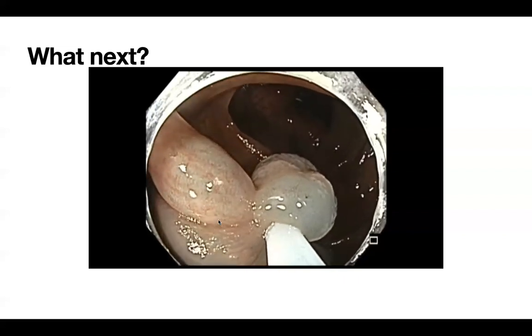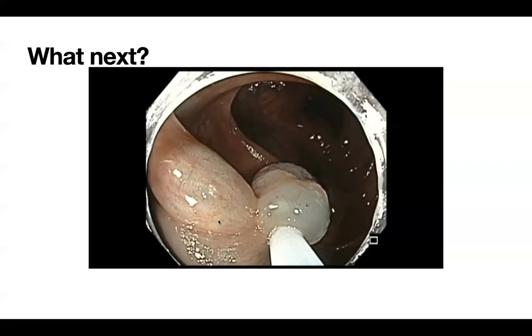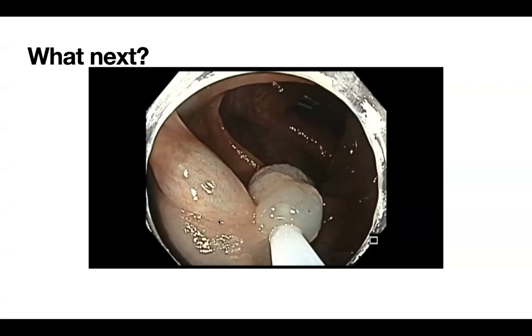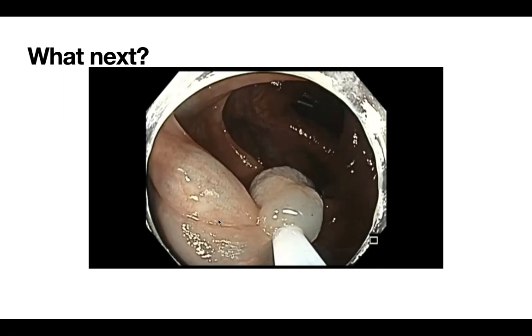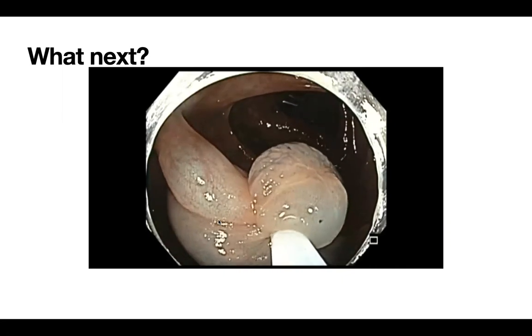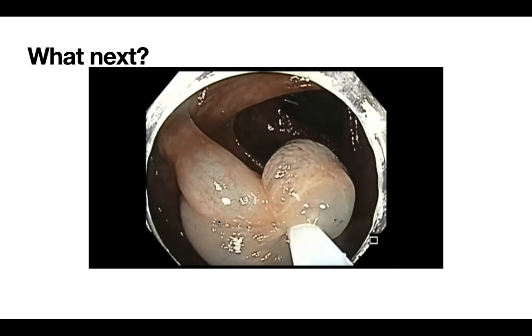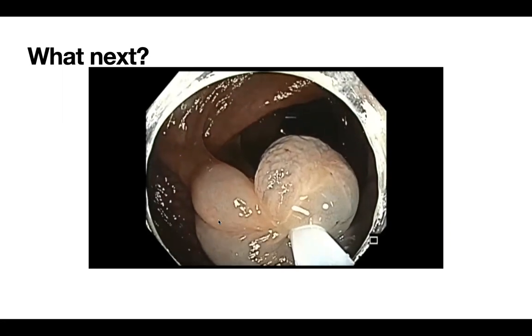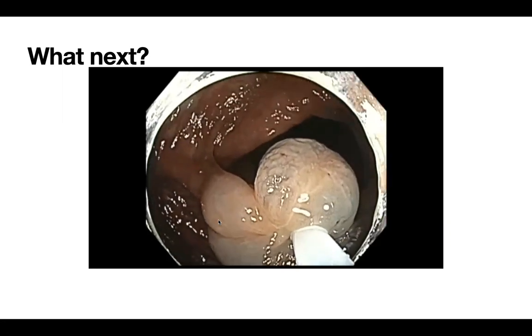As you can see here, I closed it, but then I slowly relax a little bit, relax a little bit, relax a little bit for the underlying tissue to fall back, and then close again. That technique actually saves you from deep resection. So that is something important to keep in mind.